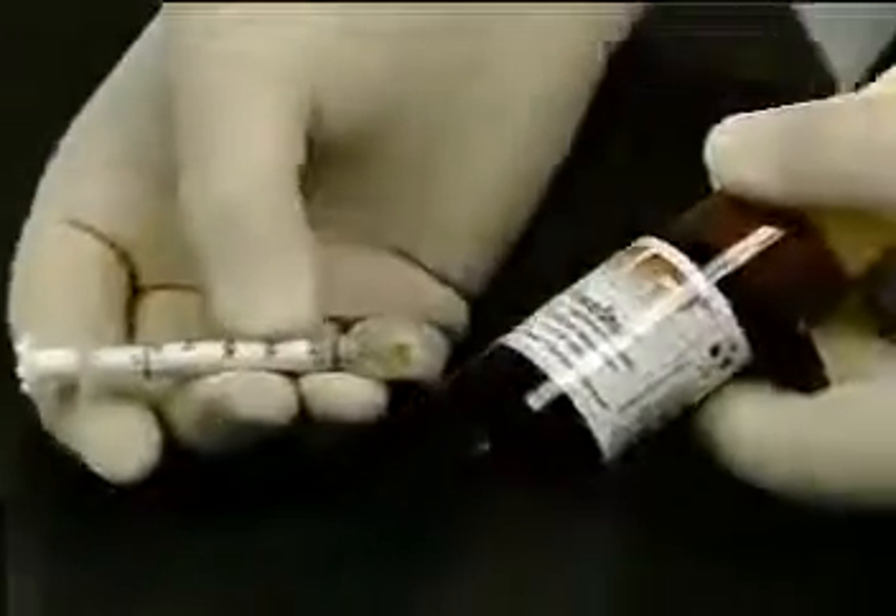Prepping has been completed, and as expected, excess blood and crevicular fluid are present. Next, a unit dose quantity of the hemostatic solution is prepared.